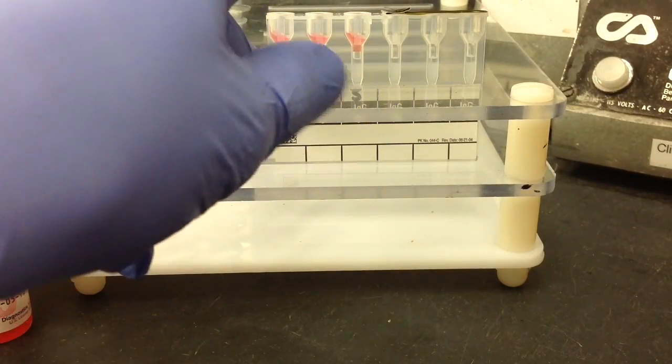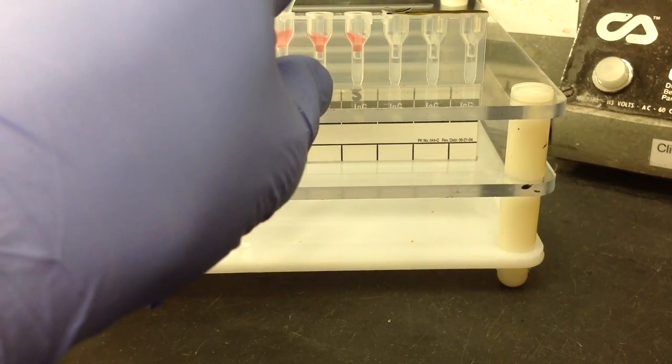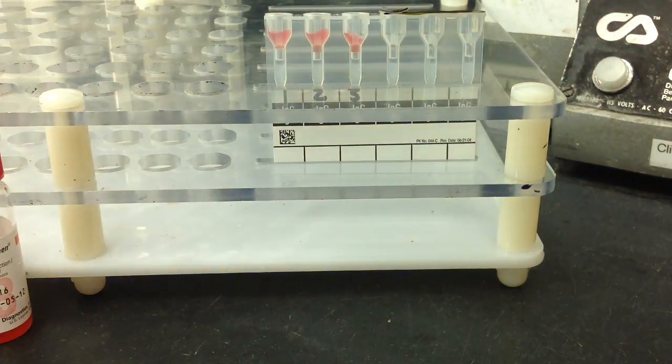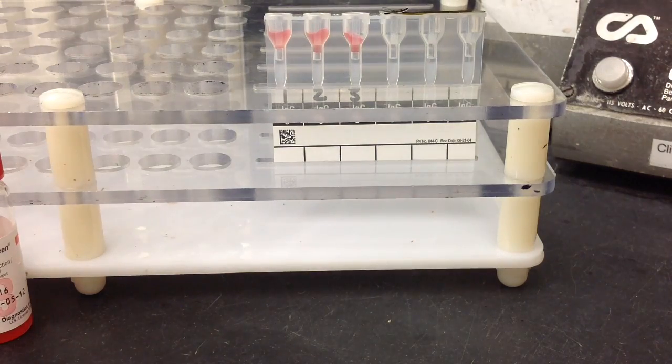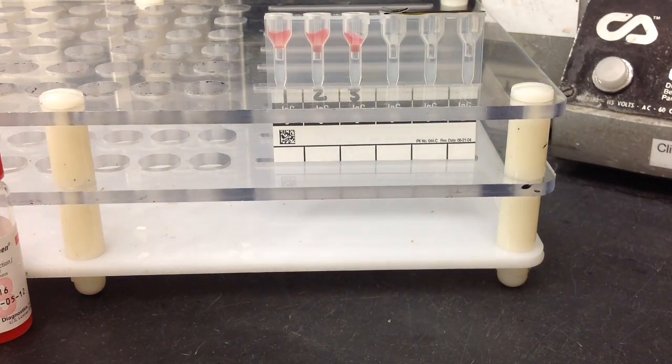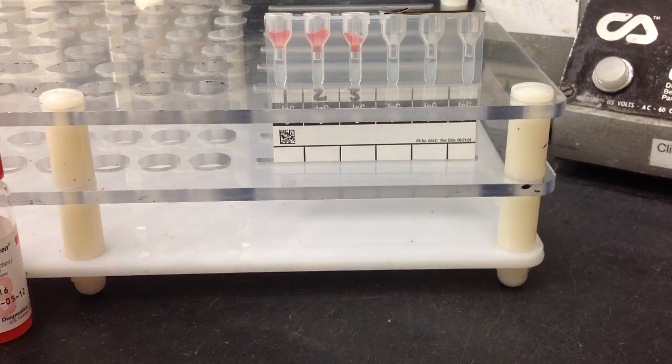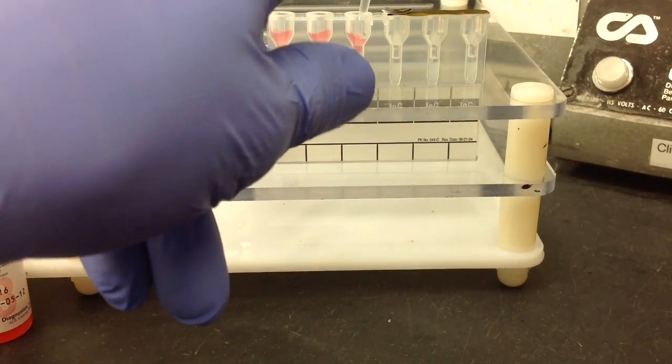So I'm going to add 25 microliters of the negative QC to the one and two reagent red cells and then I'm going to add the positive to the third. And just remember it's 25 microliters for all of these.